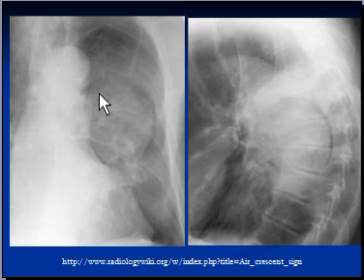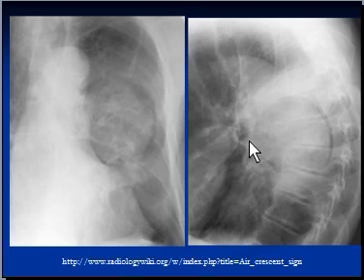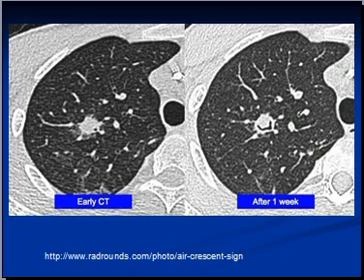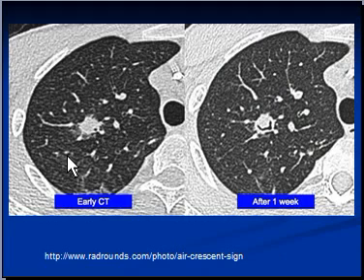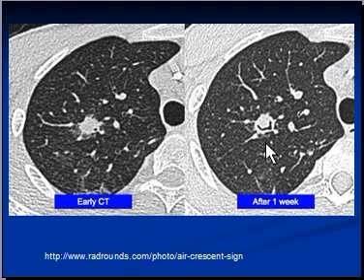Here we see a chest X-ray in PA and lateral views showing a fungus ball with the air crescent sign. This is the mass, and here is the crescent sign. Another set of CT scan images of the right lung also shows the air crescent sign. This patient was given antifungal treatment, and the air crescent sign is seen developing here.